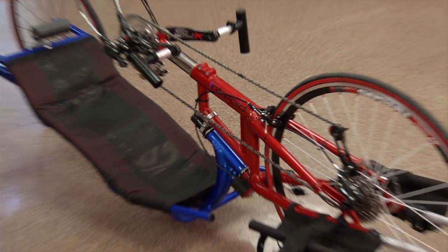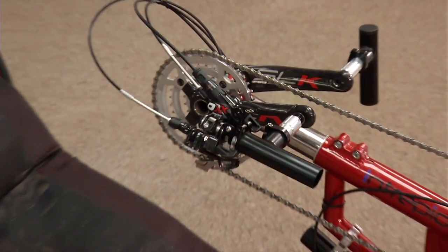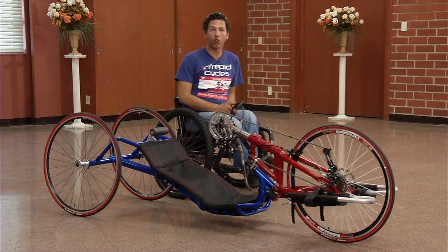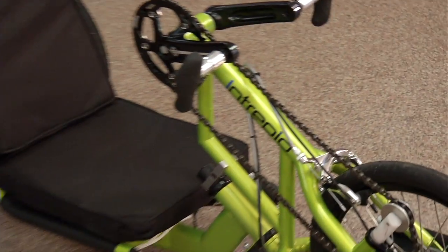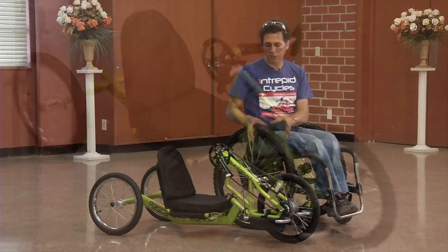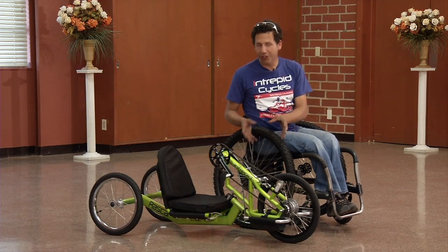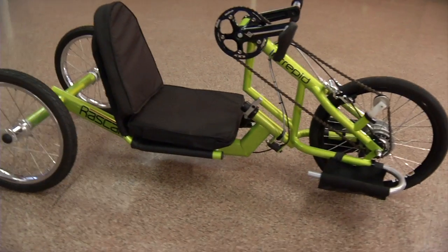This is our brand new Eclipse. It is designed as a serious race hand cycle — it's ultra-light and ultra-reclined. We also have a junior hand cycle called the Rascal, which is for little kids. The philosophy behind this bike was for a tough, fun bike for kids to just have a blast riding.